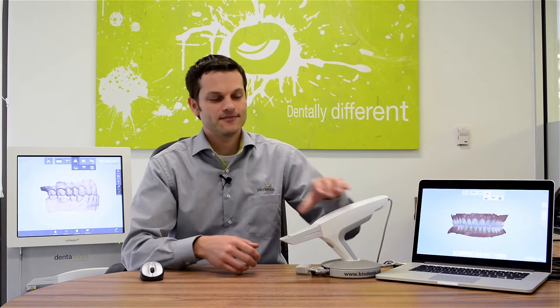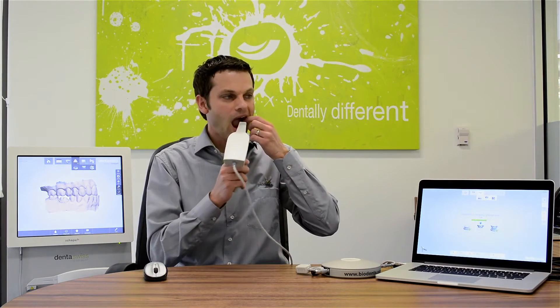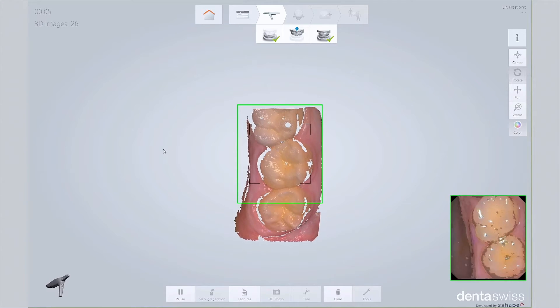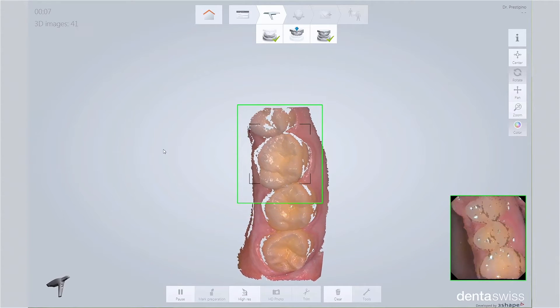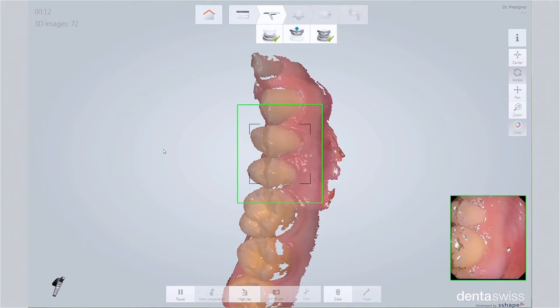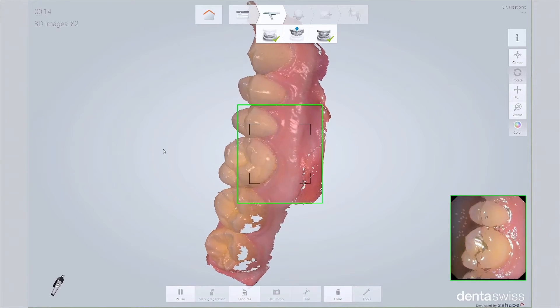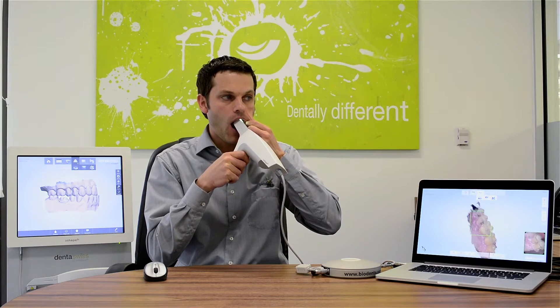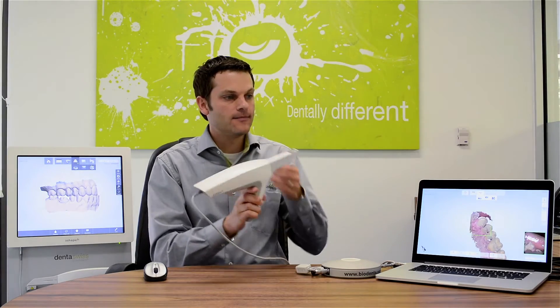On the maxilla, scan the buccal and then the lingual. Once you master this pattern, scanning is quick, easy, and predictable. I'll demonstrate. You see, it's that easy.